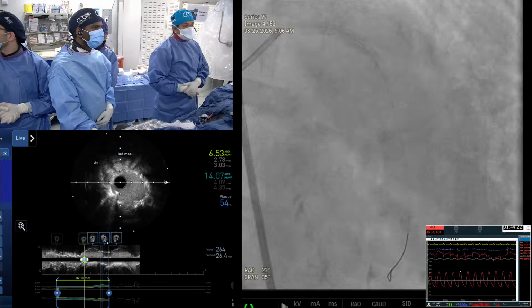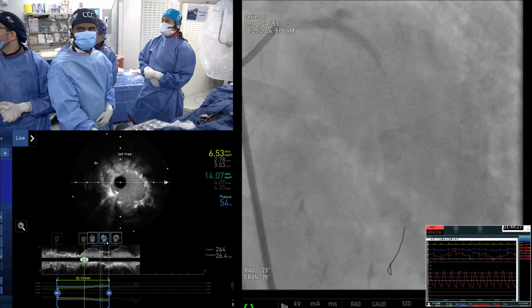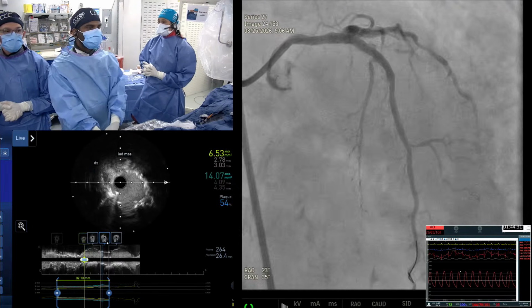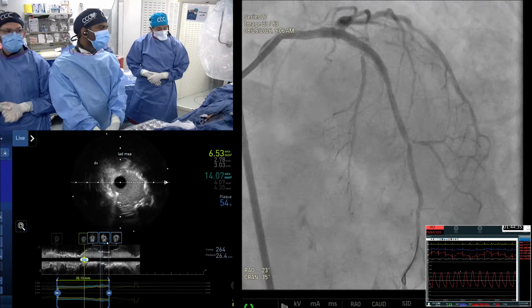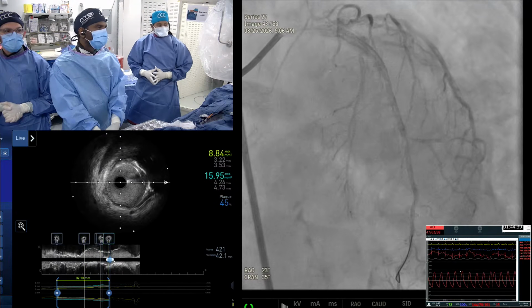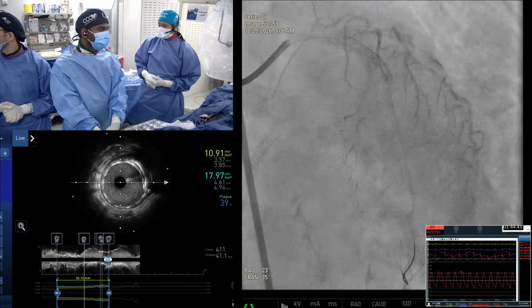You see that? No EKG changes. The EKG is back to normal now. Lead 3 actually got better, and he does not have any chest pain. So I think it's telling us not to get too aggressive in this situation, because there's a risk of destroying the LAD and left main work that we did.